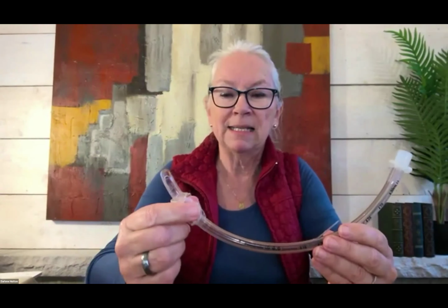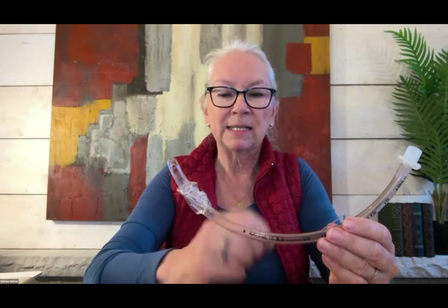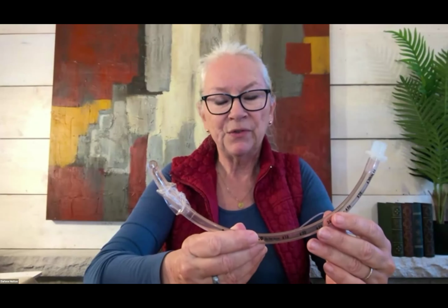So if there is imminent vomiting to happen, the risk of aspiration is far less because this tube is fully obstructing or fully occluding the trachea. This patient would need to be suctioned, of course, but in terms of aspiration, the risk is a little bit less. The downside is the skill required to insert this.